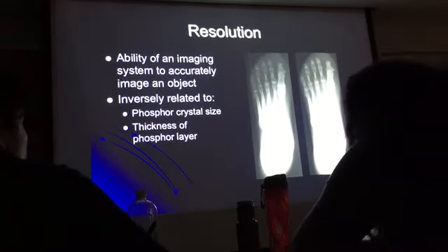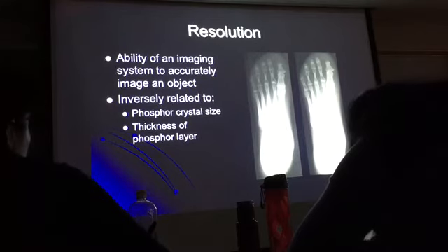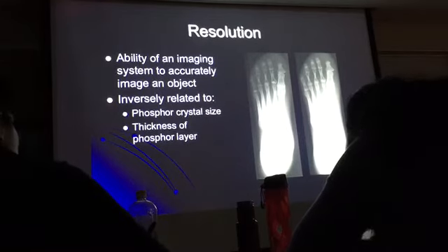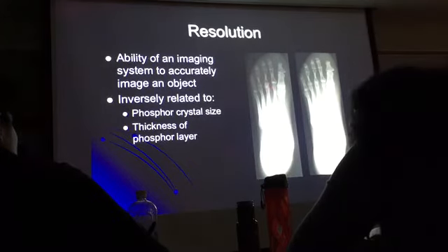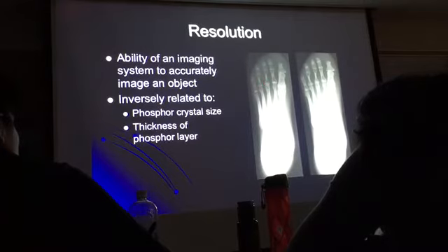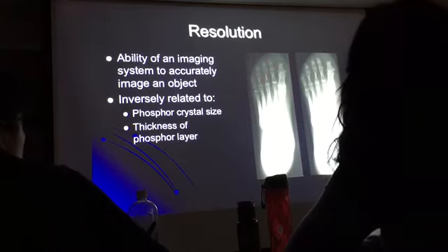So when we think of it, where can you see more trabeculae, here or here? I think the left. The left, exactly. So this one presents better resolution. We're not talking about contrast, we're just talking about resolution. This one presents better resolution because you can see more trabeculae.